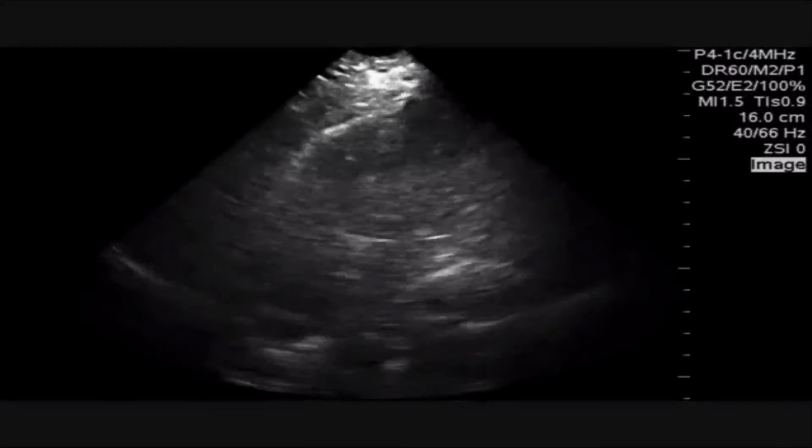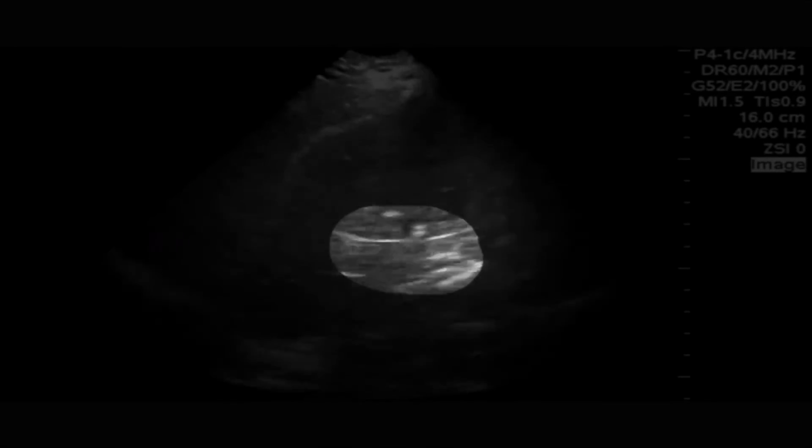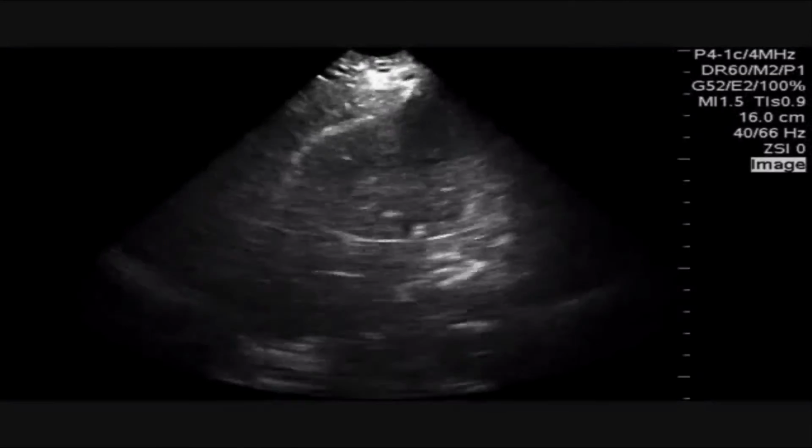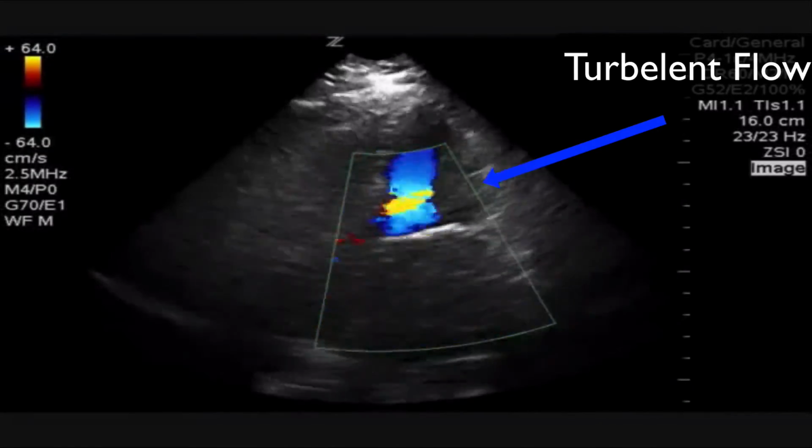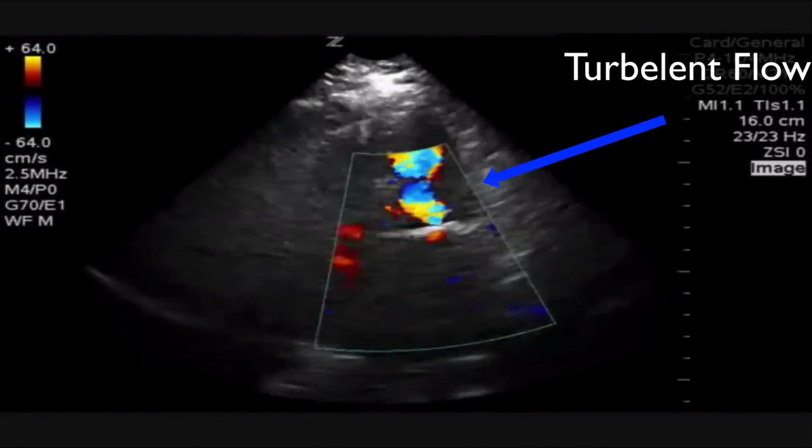For my last clip, I do an apical four-chamber. And man, oh man, what I see is a calcified stenotic mitral valve. It is bright, it is very hyperechoic, it is barely opening, it has very poor coaptation, which means that the tips of it are just not coming together. It has that hockey stick appearance where it's so calcified, it is so immobile, it just seems like it's fixed in space. Ding, ding, ding, the light bulb goes off in my head.